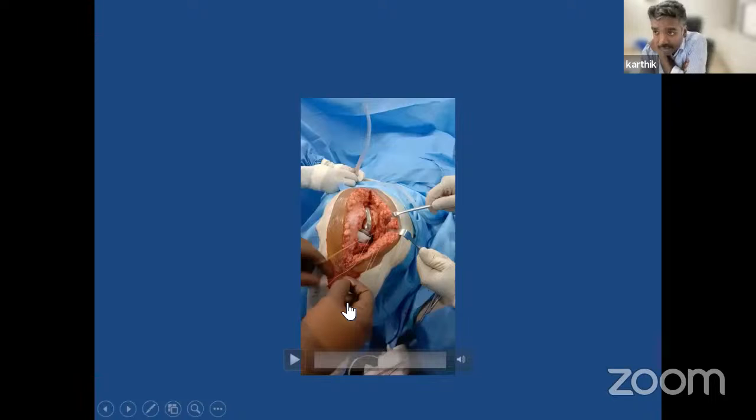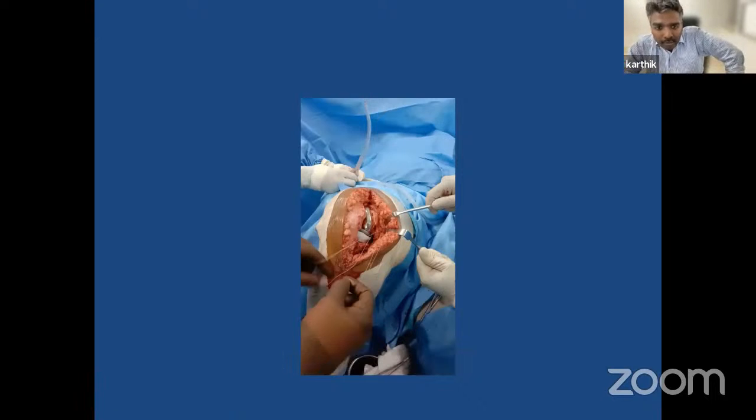See, this case was bilateral simultaneous TKR. The first side was done, everything was over, and on the second side, she was obviously obese and it was tight, and we were releasing, and I was taking an additional tibial cut. After taking the tibial cut, I was running my saw medially on the tibia, because there was a little bit of skiving from the previous cut, and I believe that saw cut probably went and cut the MCL. So the MCL was transected mid-substance iatrogenically by me. So this was an iatrogenic mid-substance MCL rupture.